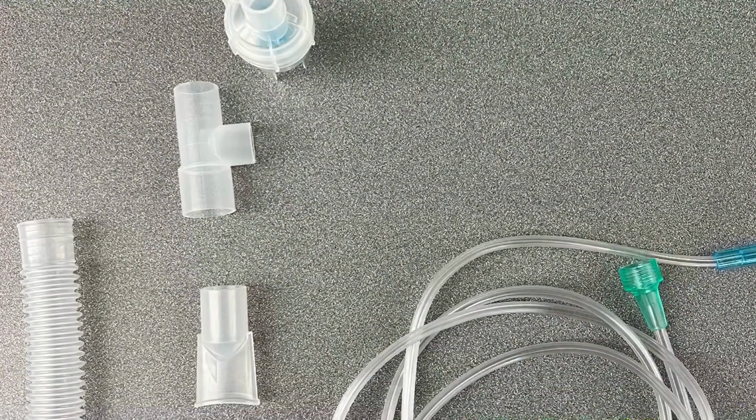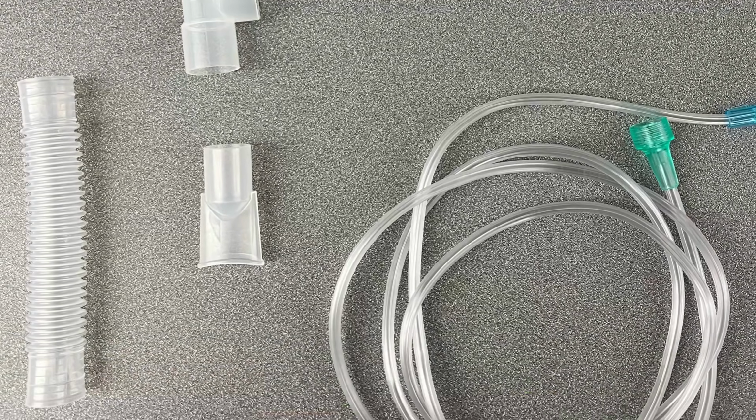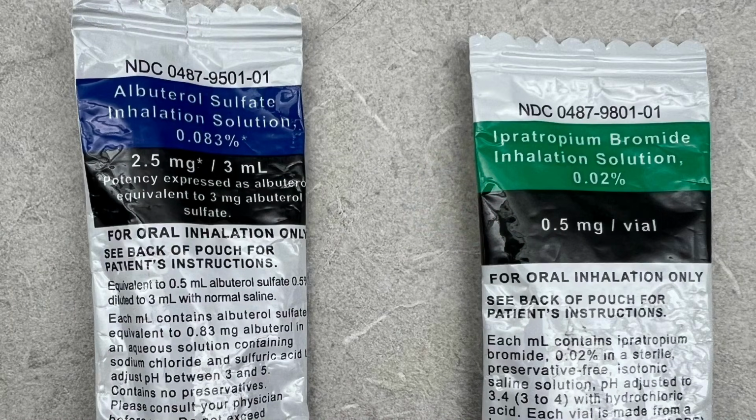To begin, make sure you have a standard nebulizer kit, including a nebulizer chamber, a T-piece, corrugated tubing, and oxygen tubing. You also may need several adapters based on the equipment your department uses and what's available in your area to connect the BVM to the T-piece and the actual nebulizer setup to the advanced airway. Prior to performing the procedure, it is recommended you select the appropriate medications and perform a medication cross-check.